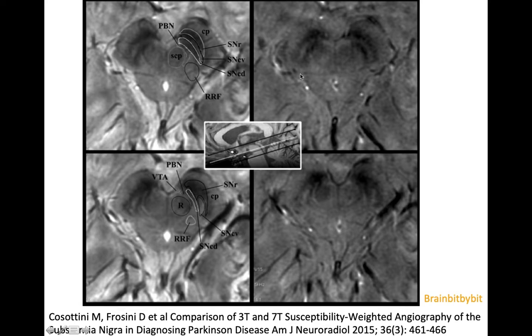On the 3 tesla images, when there is loss of the dopaminergic neurons that are slightly hyperintense, this might lead to blurring of the boundary between the red nucleus and the also hypointense reticulata part of the substantia nigra.